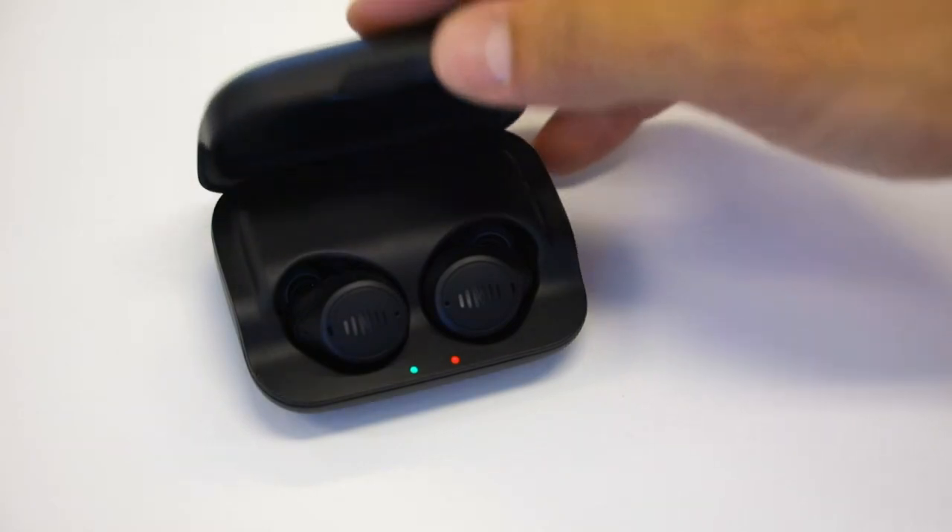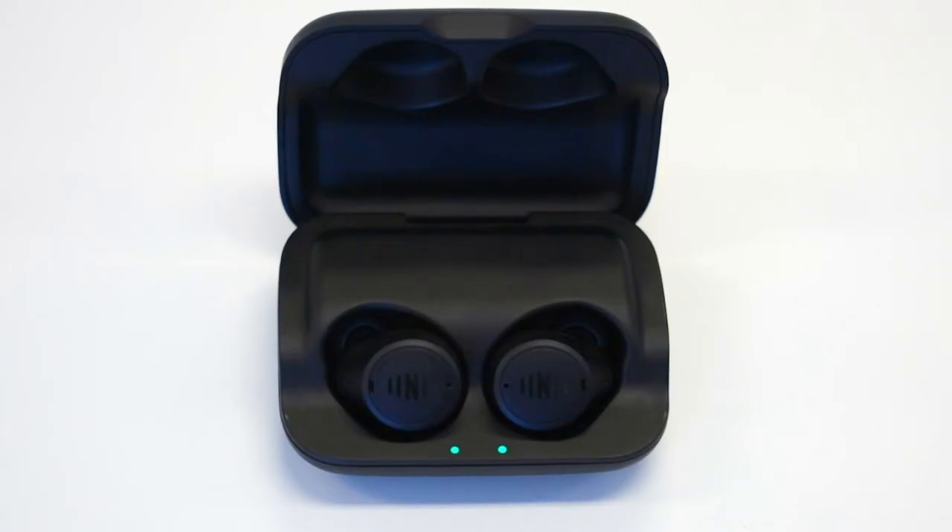First you will need to place your buds in the case. Please note that the lights will turn on when the case is opened or closed. The lights will then turn off after a few seconds for battery efficiency.